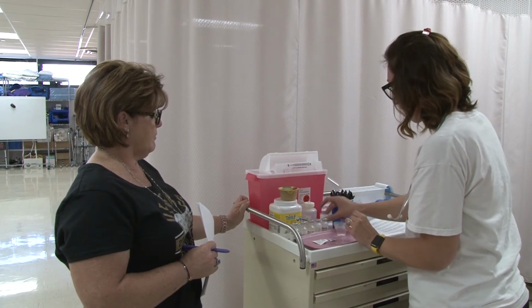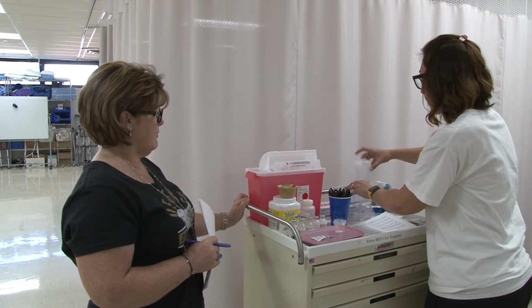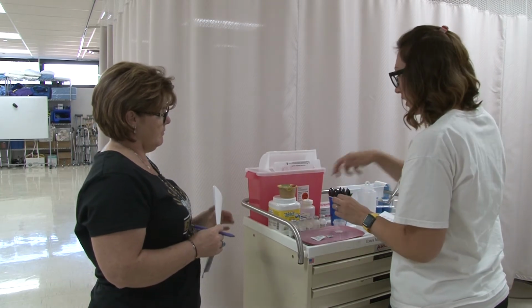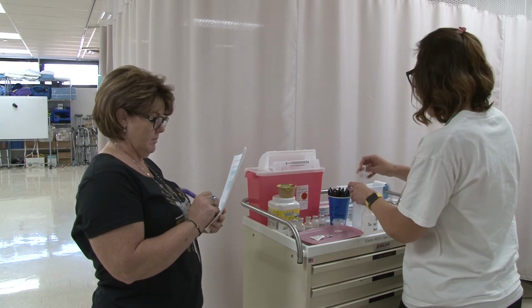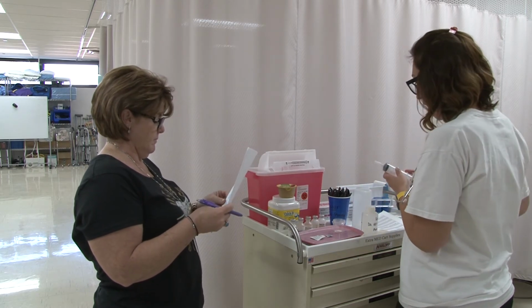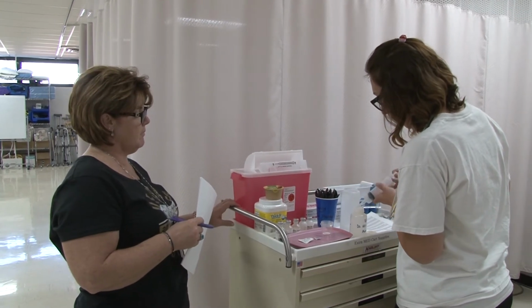That's there. I'm going to get my 60 ml piston syringe, and I'm going to go ahead and dilute these 2 medications in approximately 20 mLs of sterile water, or normal saline, or tap water.